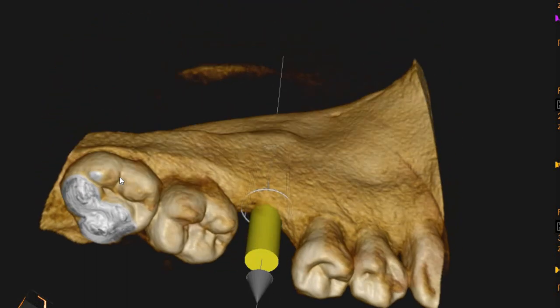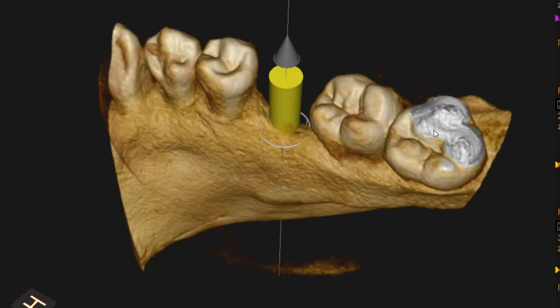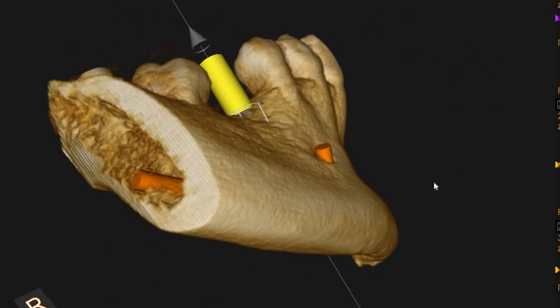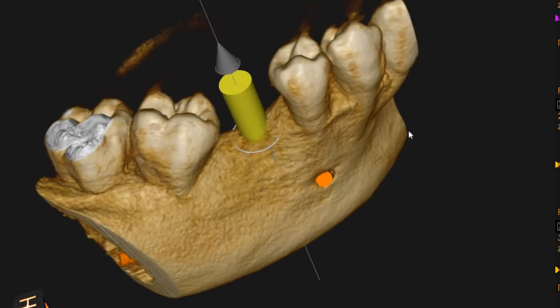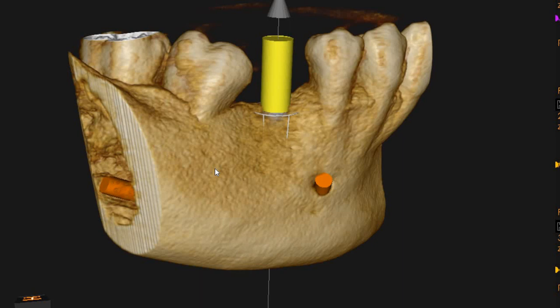You can see that the implant has been placed and there's absolutely no implant thread exposure on the 3D rendering. If osteodensification burs can be used, that would also increase the width of the ridge and will also enable a thicker implant placement. But a 4.1 to 4.3 or a 4 mm implant can ideally be placed in this scenario.